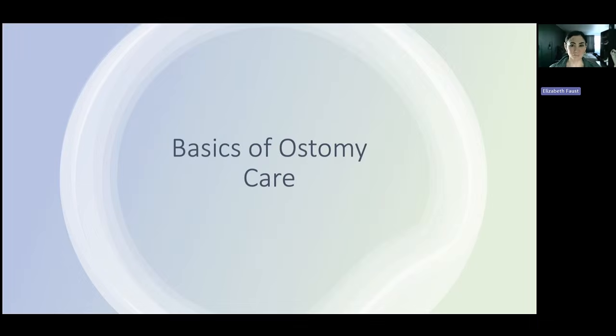We're here to talk to you today about the basics of ostomy care. In the next 30 minutes, we're going to cover what an ostomy is, the different types of ostomies, why you might have one, different terms that you should be familiar with, whether you are an ostomate or take care of ostomates, how to empty a pouch, how to change a pouch, how to stoma site somebody, or if you are getting an ostomy or a stoma, what you should be aware of when they are marking the spot, accessory products, and skincare. And also be sure to stay tuned at the very end for a free resource as well.